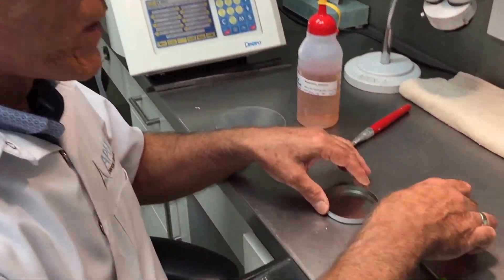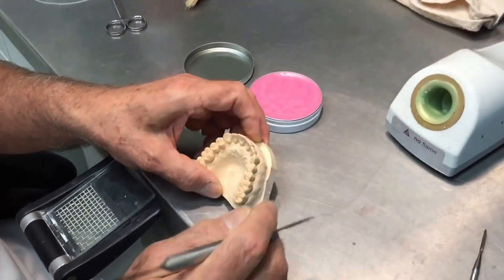This way, the Thermo Wax can be boiled off and we can carry on and use the model to make a mouth guard, as a study model for other purposes, or simply to keep for our records. So we're going to take the Thermo Wax and apply it to our model.